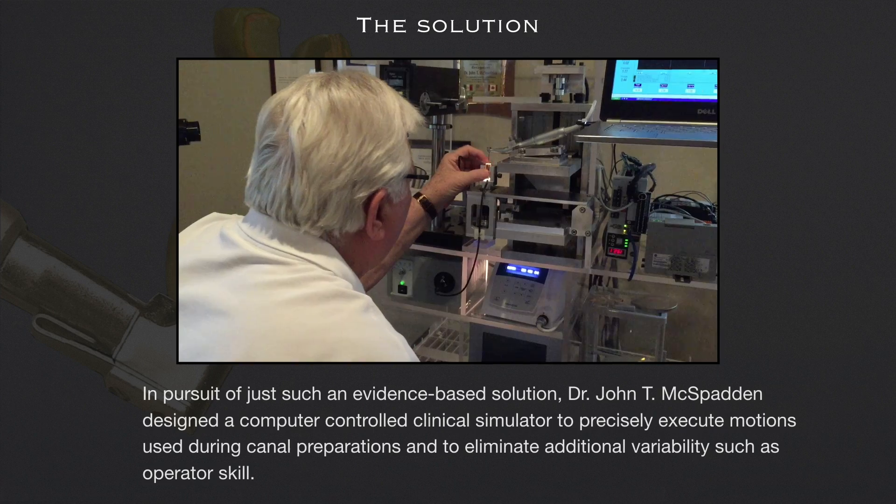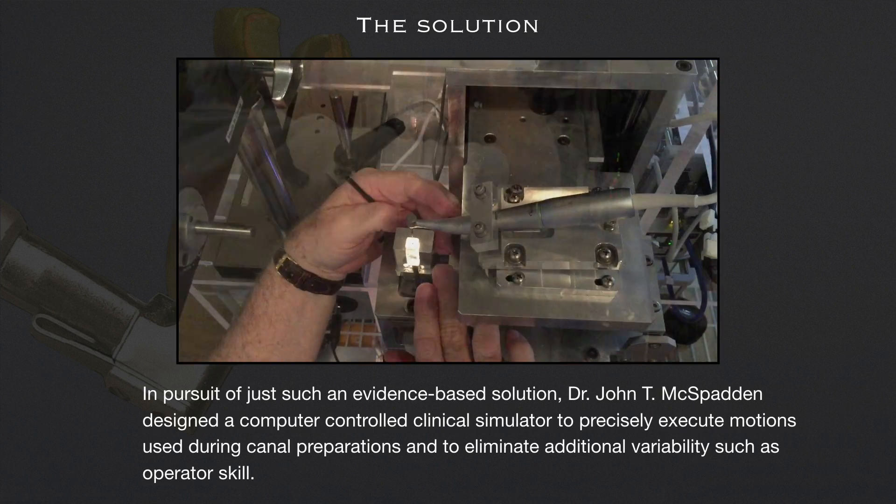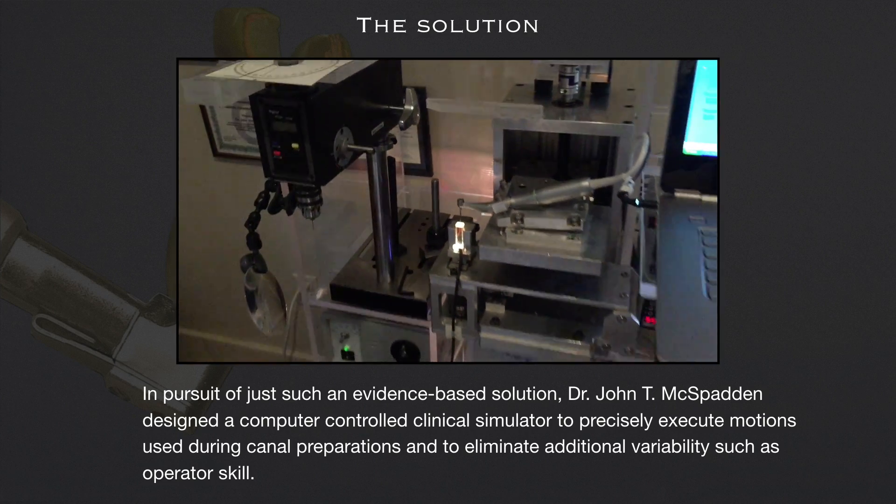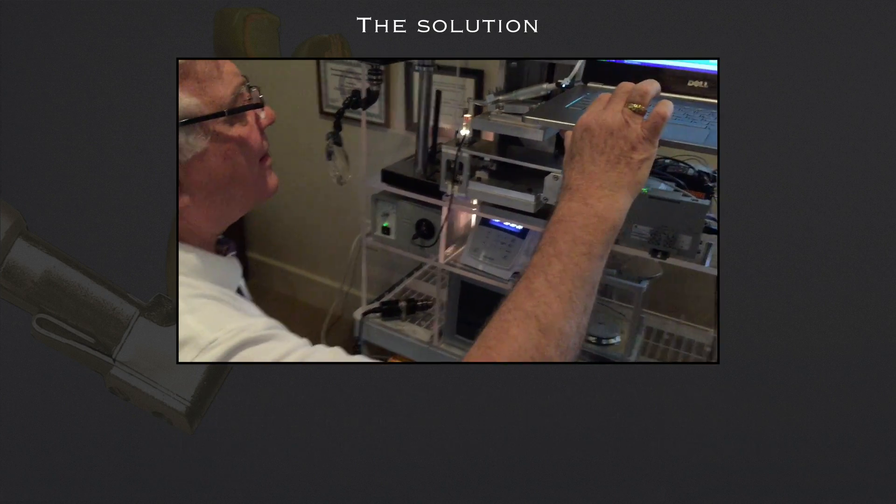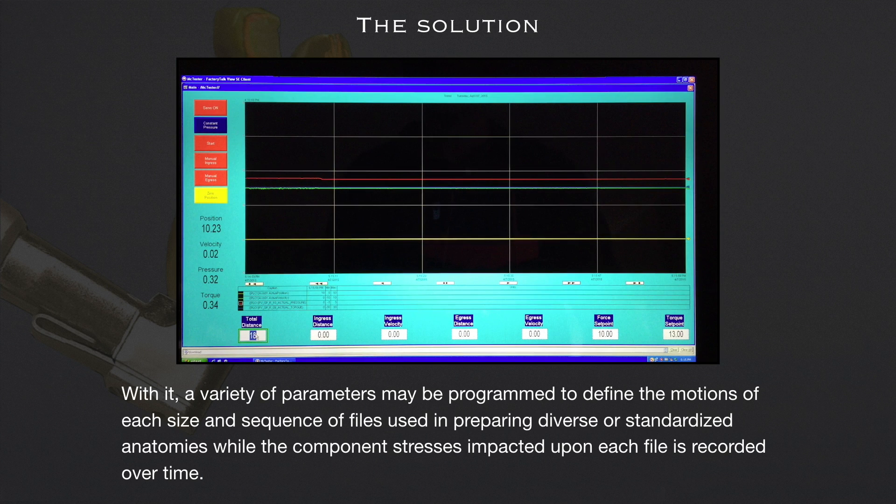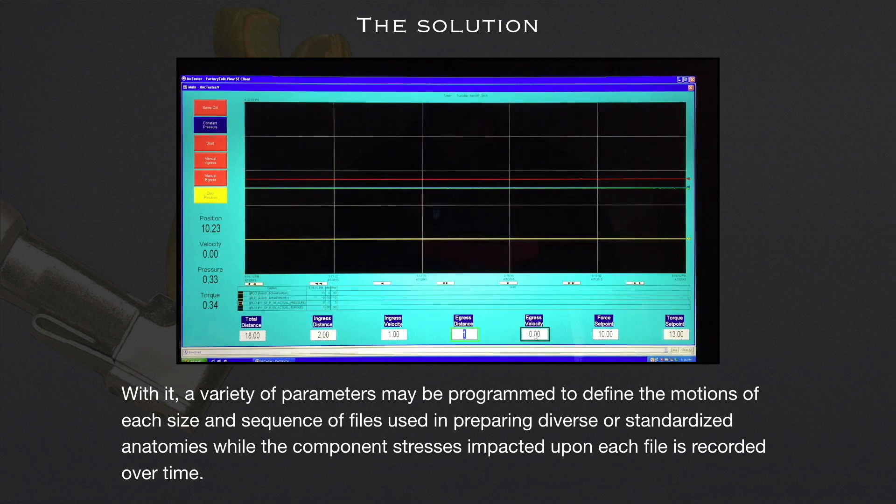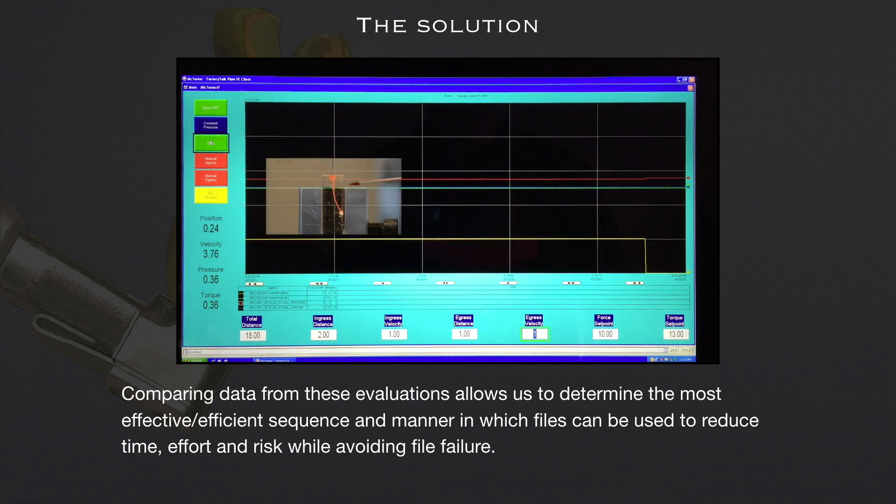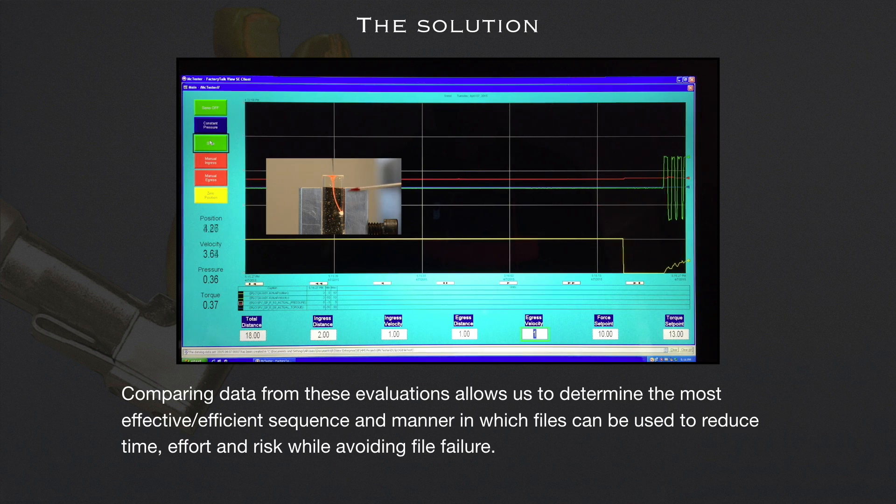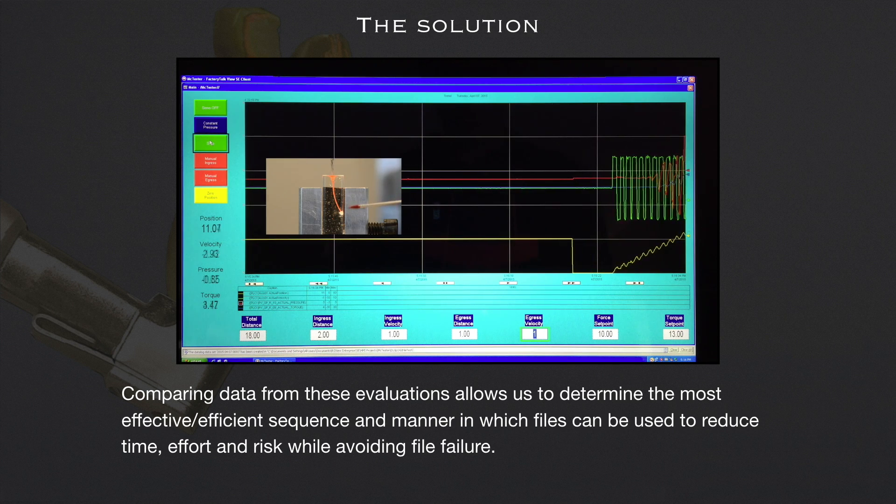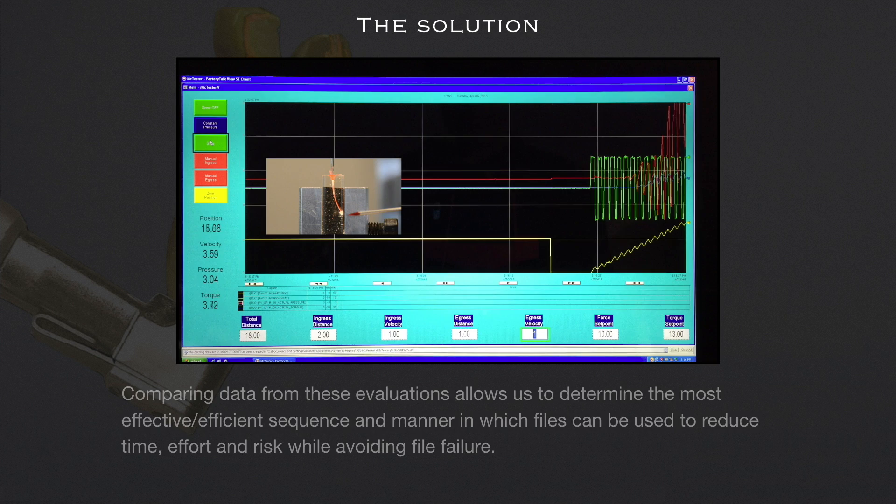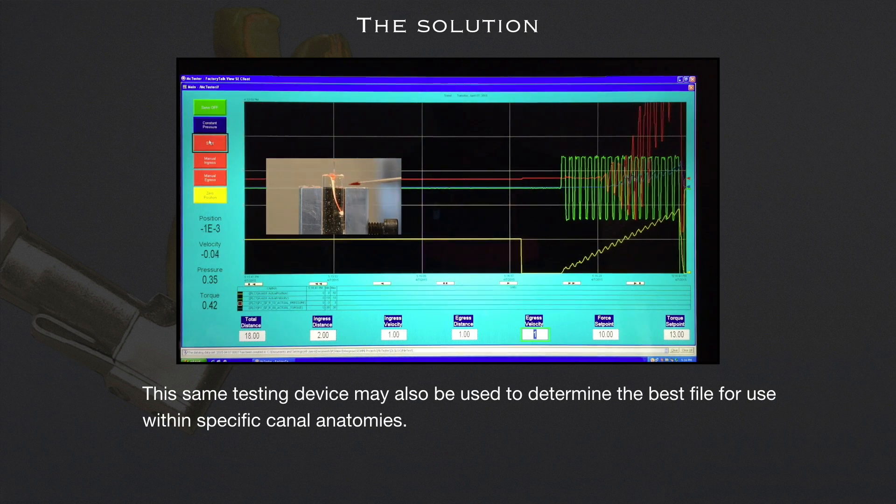In pursuit of just such an evidence-based solution, Dr. John McSpadden designed a computer-controlled clinical simulator to precisely execute motions used during canal preparations and to eliminate additional variability such as operator skill. With it, a variety of parameters may be programmed to define the motions of each size and sequence of files used in preparing diverse or standardized anatomies, while the component stresses impacted upon each file is recorded over time. Comparing data from these evaluations allows us to determine the most effective or efficient sequence and manner in which files can be used to reduce time, effort, and risk while avoiding file failure. This same testing device may also be used to determine the best file for use within specific canal anatomies.